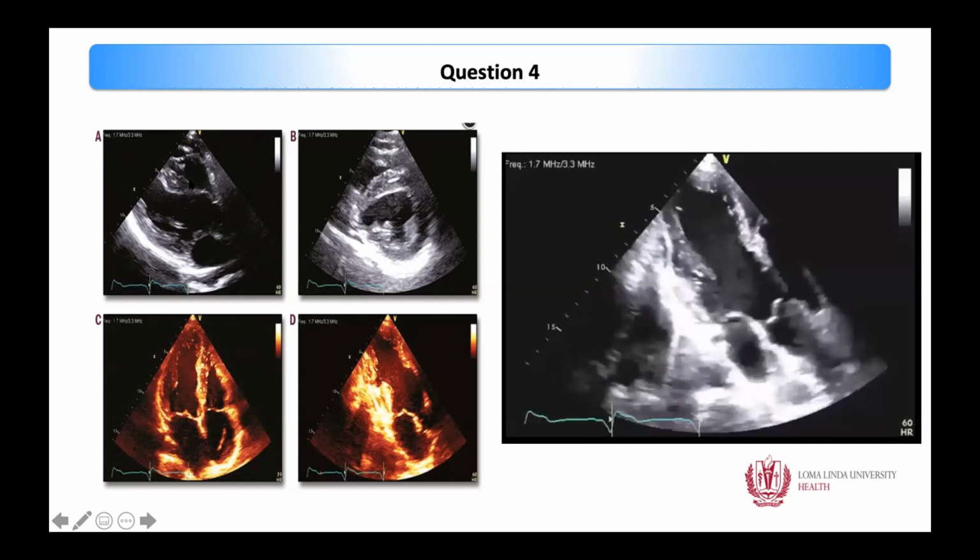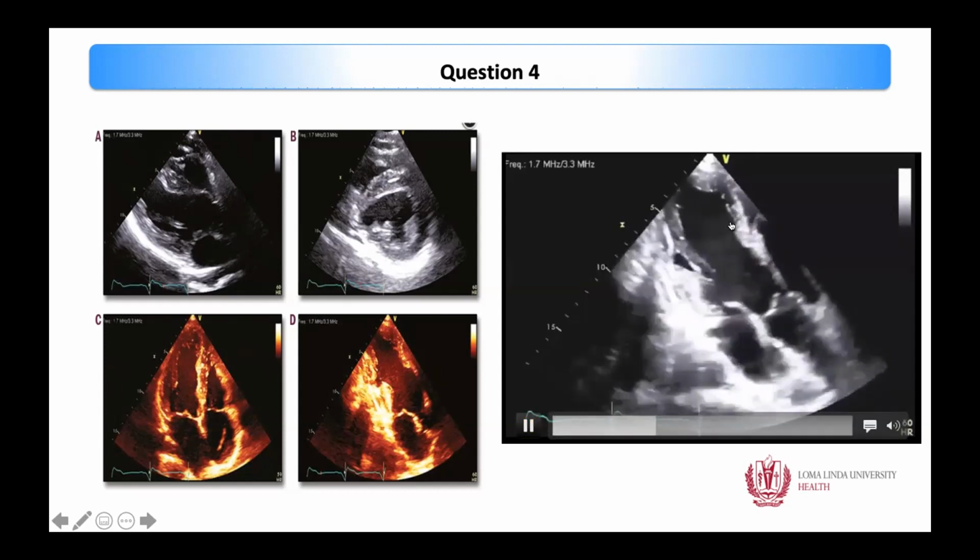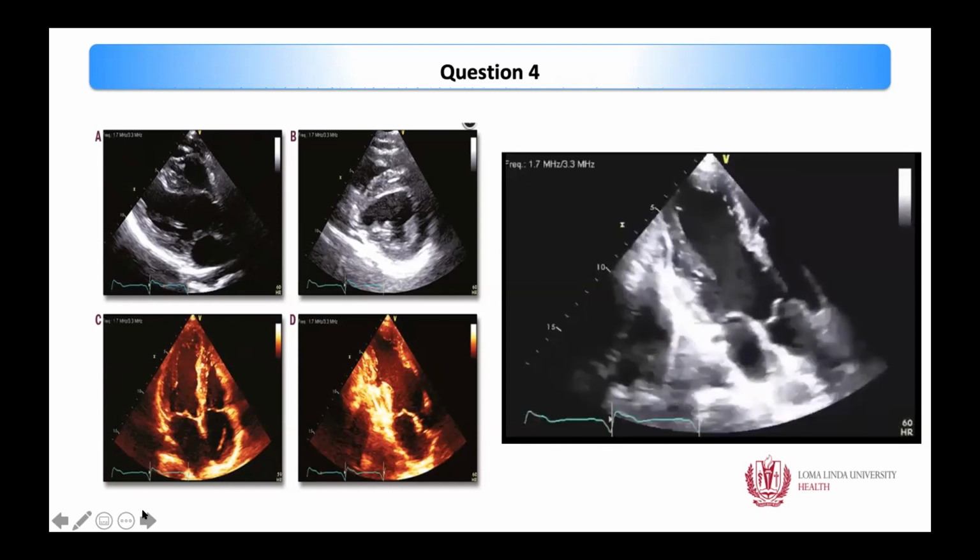So you have quite a thin anteroseptum. There is some wall motion abnormality in other parts as well, but the patient has intraventricular conduction delay. So part of the wall motion abnormality, at least in this area, can be attributed to that. But this portion gives away the diagnosis. So this is a case of cardiac sarcoidosis.